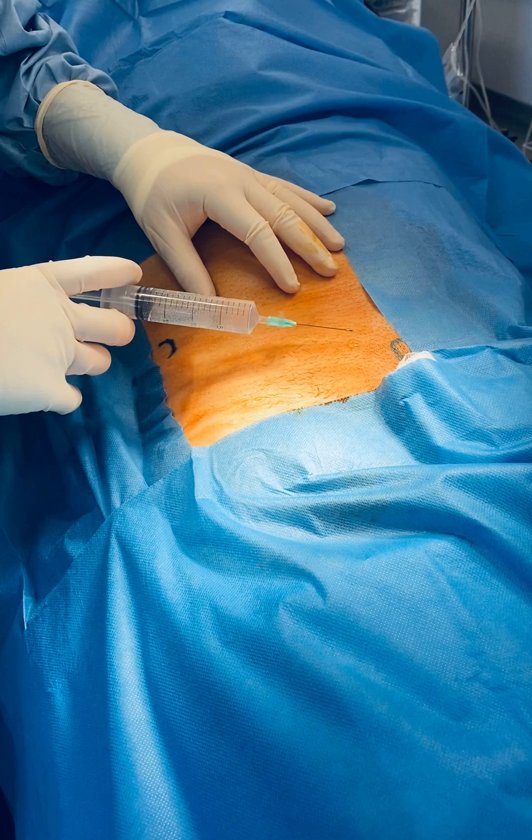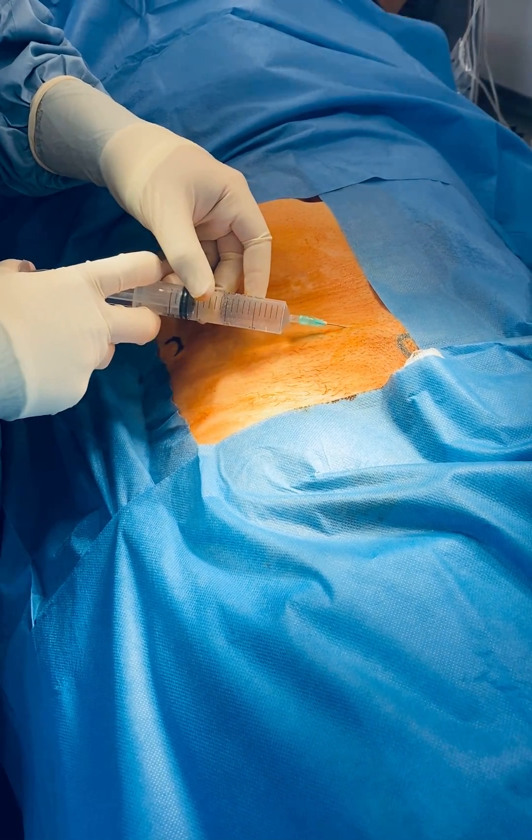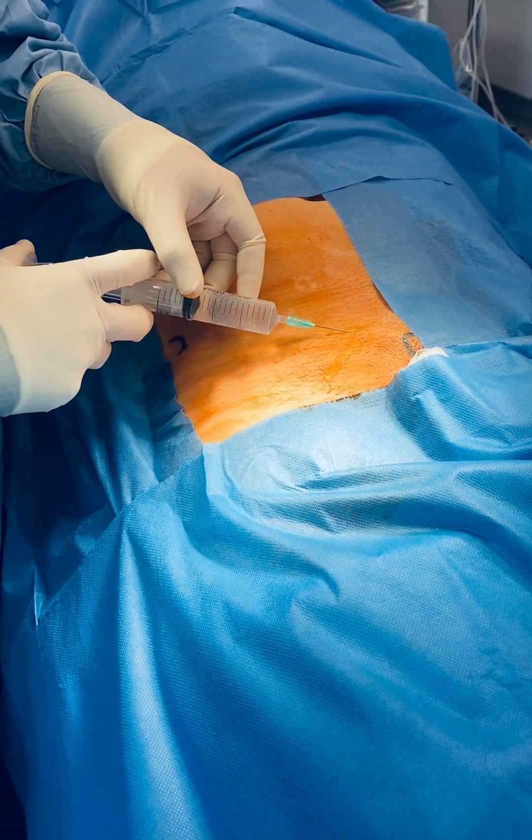50% of the local anaesthetic is going in superficially, so around our incision a subcutaneous infiltration takes place here.